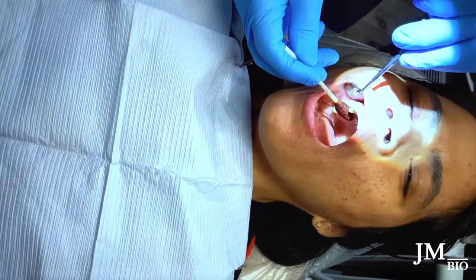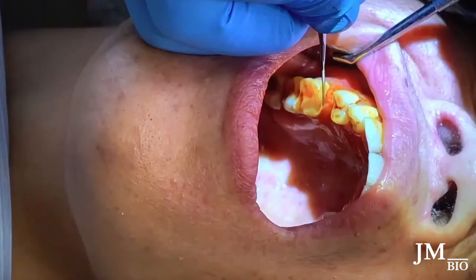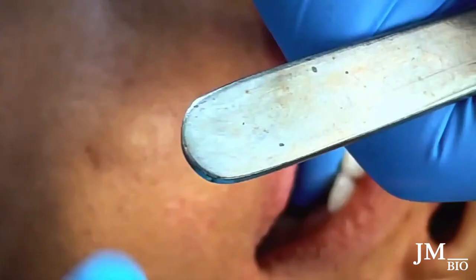She has a lot of tartar back here — she needs SRP but hasn't been coming in. She wanted the implant done, so I'm taking a periotome and trying to scrape off the tartar, but it's not coming off. I'm still deciding whether to lay a flap — she has a pretty nice wide ridge so I could have done this case with just a punch.